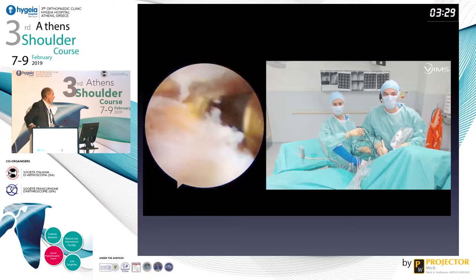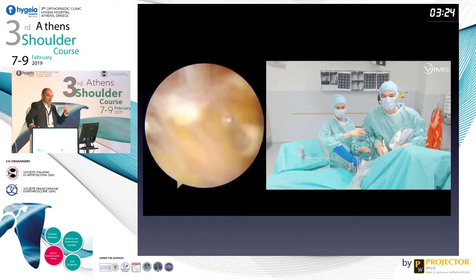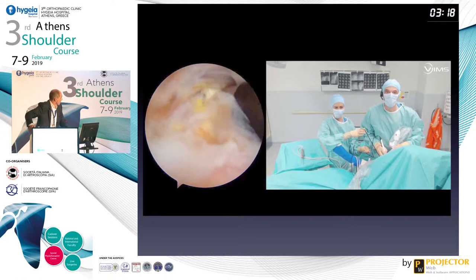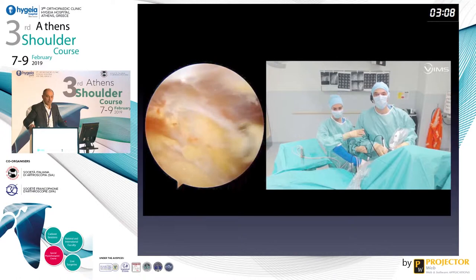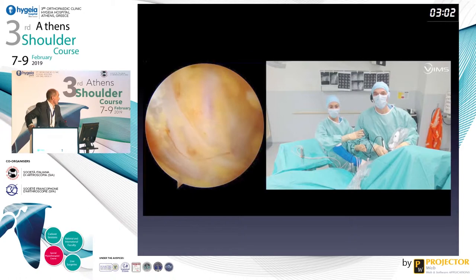So after this release, of course, you have to prepare the way, and the lat dorsi is done now. I am preparing the space just behind the conjoint tendon to the footprint of the subscap. You have to take care because you are just behind the conjoint tendon, and you know that in this way you have the musculocutaneous nerve and the axillary nerve. So I am looking for the vessels. Here you can see the circumflex vessel with a nerve. So you have to cross this area.